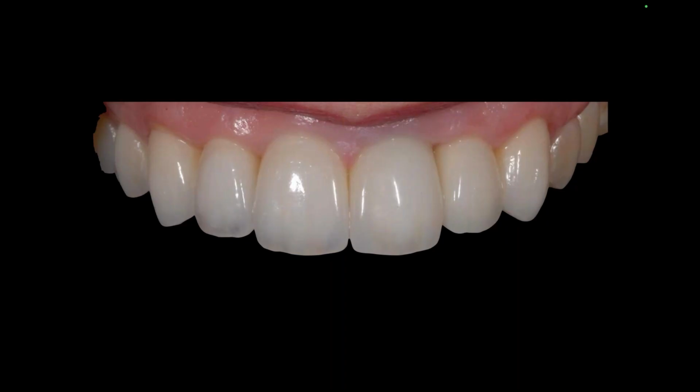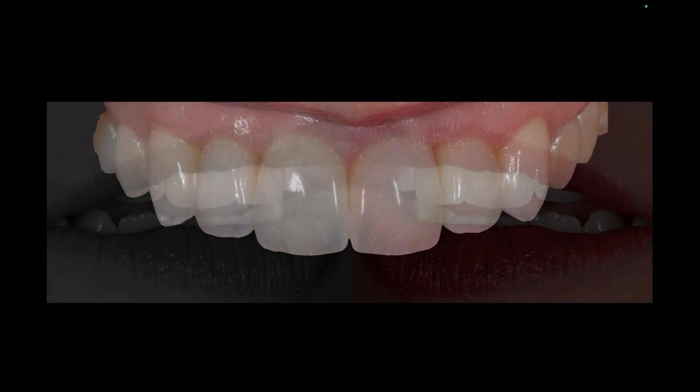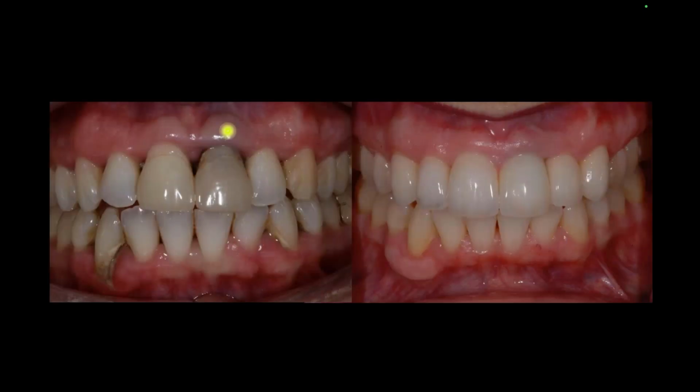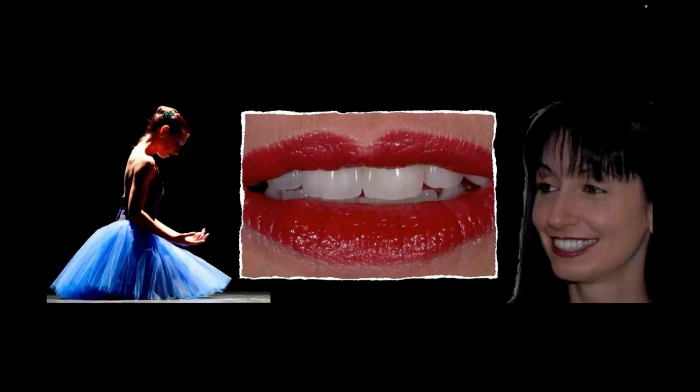The good news is she doesn't really show all the way up there, but you can see that I've accomplished mostly the translucency and opacity that I needed into it. And the biggest part is, again, from the full face, when the patient smiles and what they show in a normal world works. Could I have fixed everything here? Yeah, there are other ways we could have talked about this, but not for today's lecture. But that was a very interesting case a long time ago that I did. So it worked in that scenario.